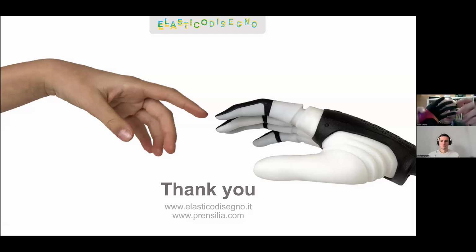The last iteration, which is the one I'm holding here, doesn't use actual silicone. It's a different kind of soft plastic. I don't remember the exact specification, but it's not actual silicone anymore. It provides a better attachment to the plastic part and a better grip for the user. Because even though silicone is soft, it didn't provide enough grip in some usage cases. So that's one of the areas where we've done the most adjustments, because every patient gives their own feedback, and the project can be adjusted accordingly.